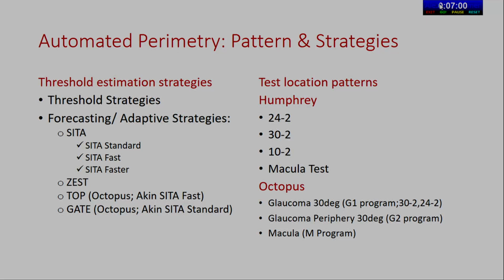We are all aware of the common test patterns that we use for glaucoma: 24-2, 10-2, and in advanced cases, the macular test. I'll be focusing primarily on the Humphrey field analyzer.